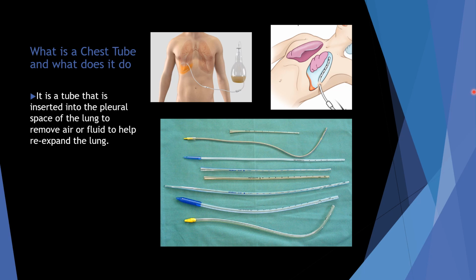I'm not going to go into actually showing videos or anything about insertion. You can pull that up and look at that at your own leisure on the internet on how to insert a chest tube and discontinue a chest tube if you like.